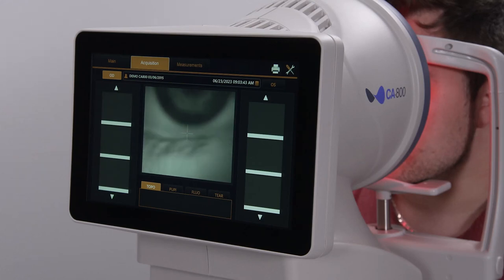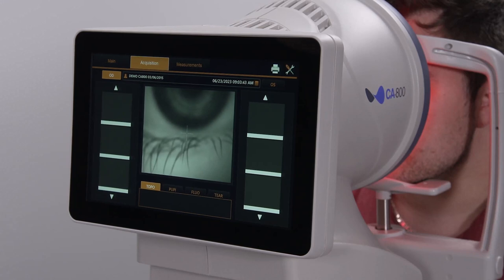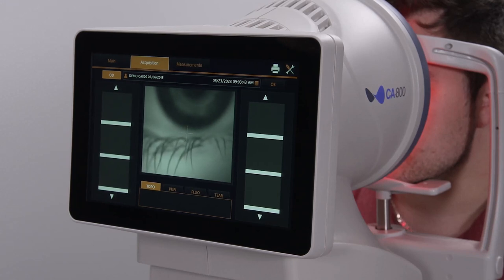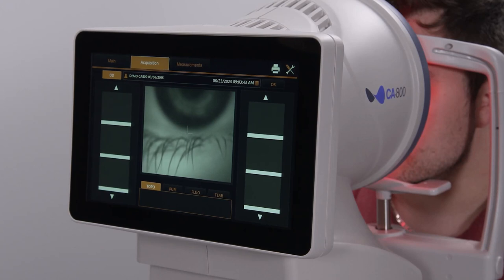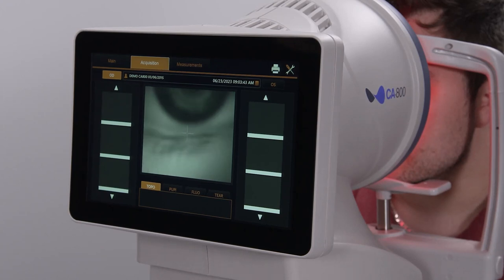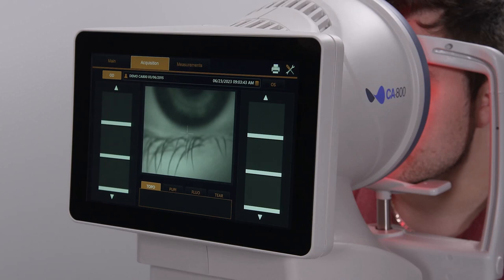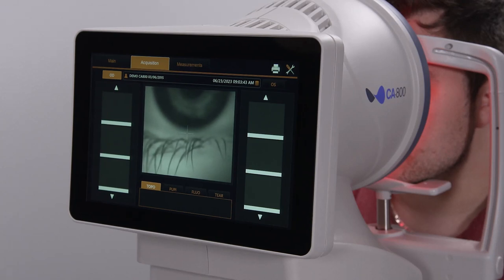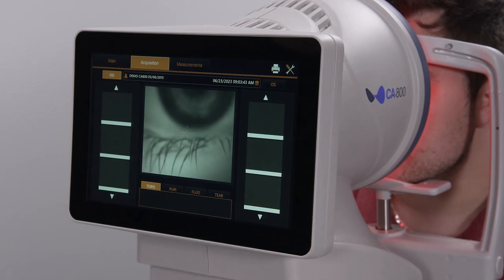Meibomian gland imaging is an important part of any dry eye examination. The CA800 captures and quantifies gland loss to support clinical decision making and monitoring the effectiveness of treatments. Since eversion of the upper lid can cause some tearing, it is best to leave meibomian gland assessment until after the assessment of tear meniscus height and breakup.